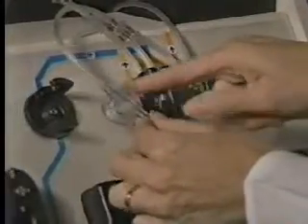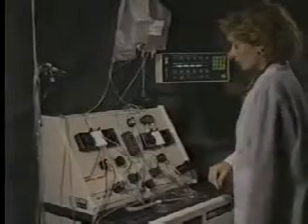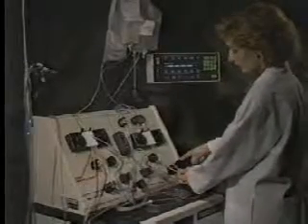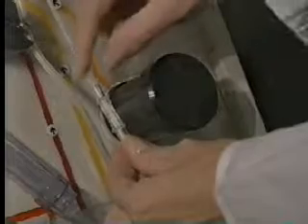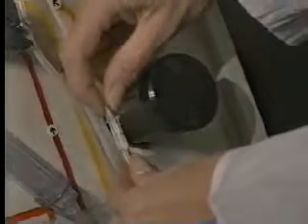Place the return pressure sensor in the return pressure sensor housing. Push downward and turn clockwise to lock in place. Next, you install the cuvette into the collect concentration monitor, commonly referred to as the CCM. Remember to avoid touching the center of the cuvette because fingerprints may decrease the accuracy of its readings. Note that the cuvette slides freely on the tubing.